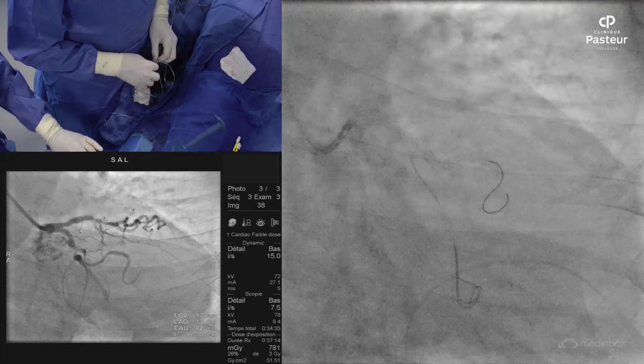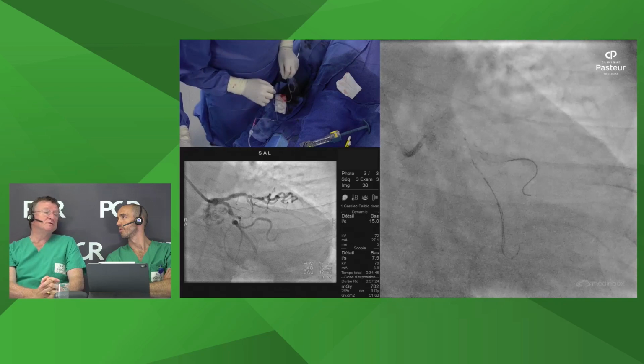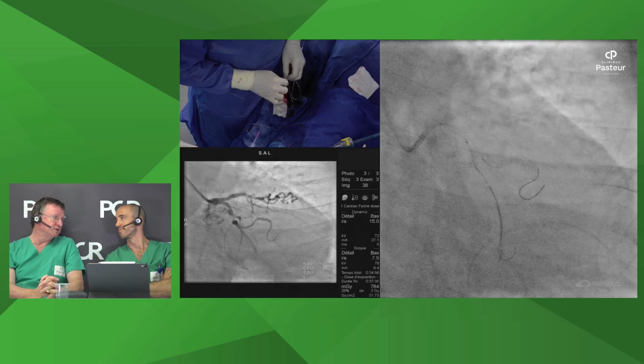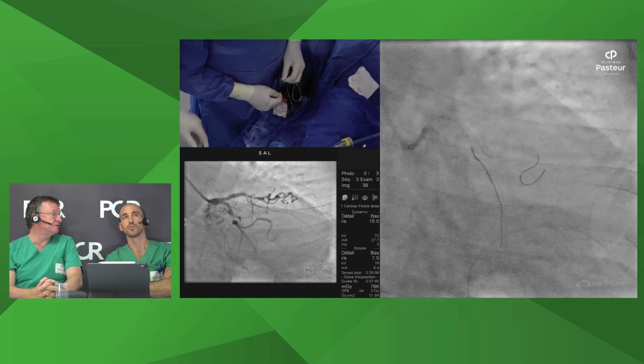We have a question from Romania. Do you use IVUS sometimes for this kind of difficulty? Look, an IVUS would be great, but there's no way an IVUS probe is going down that vessel. You can't get a balloon easily into it. So I think trying to pass an IVUS probe down there will be really difficult. Sure, if you could get it down and assess the wire position in relation to the stent struts, great. But I just don't think you'd deliver an IVUS catheter. I have no experience using IVUS to pass through the stents.